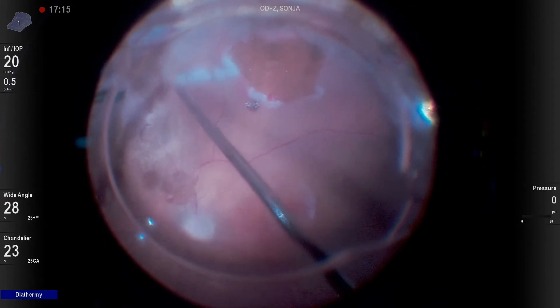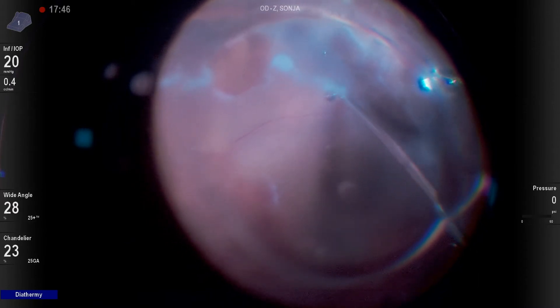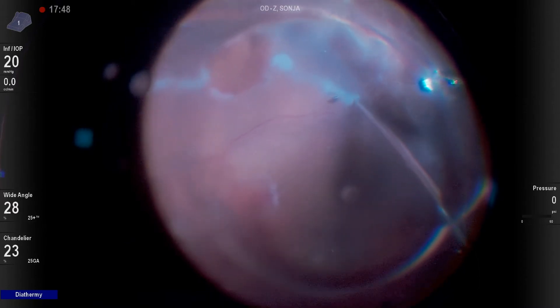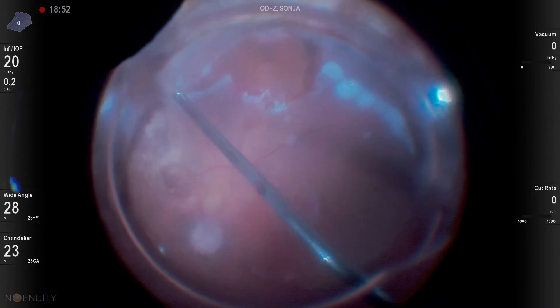I never take the oil out of the patient's eye. I can now go back from the edges of those areas and continue my diathermy to make my 180 degree retinectomy.